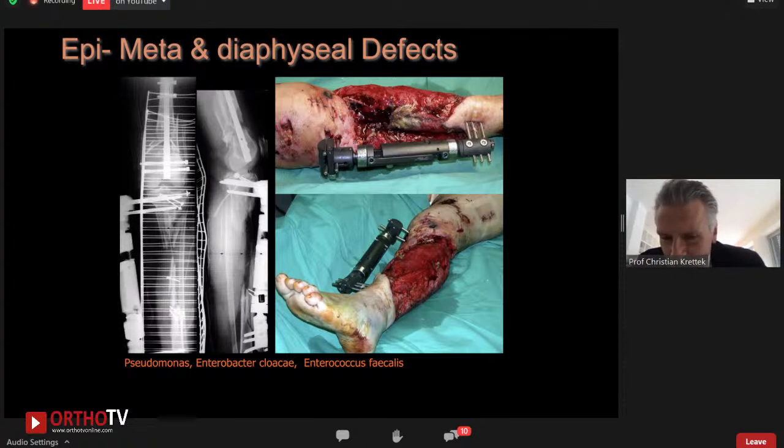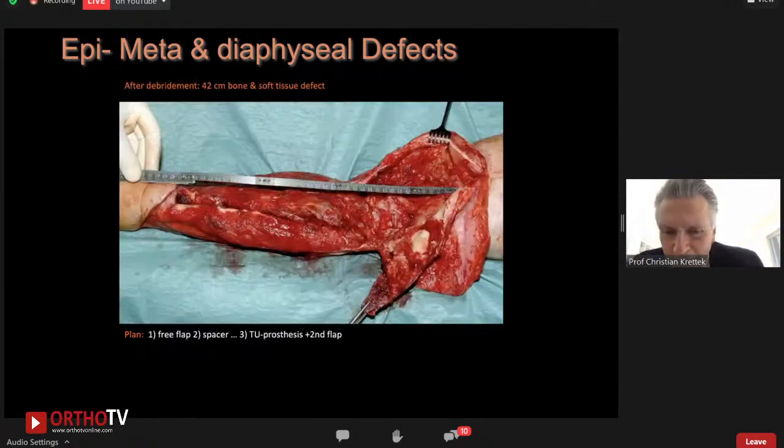Every patient with open fractures coming from other places gets the welcome debridement, so that we see from inside the wound. We judge the wound in person, we wash out everything, to have some sort of a starting point. So we did this, and then debrided her. All the implants were infected, also the knee joint, and we removed all infected bone. And that's what we got.